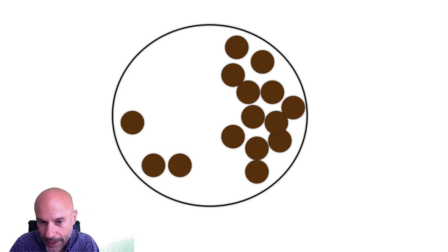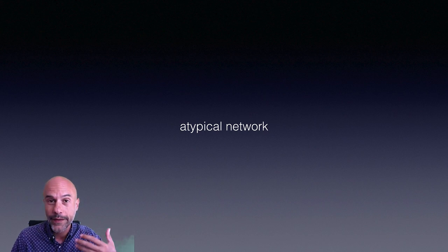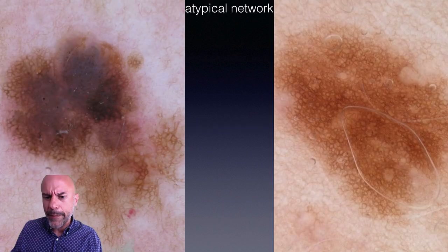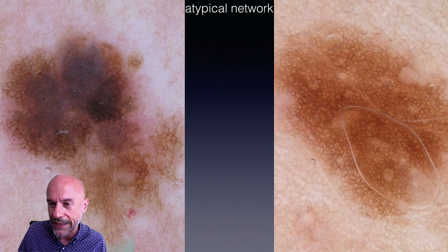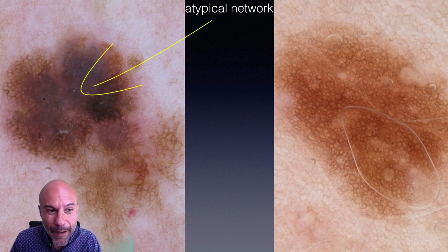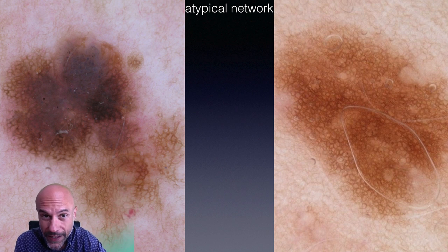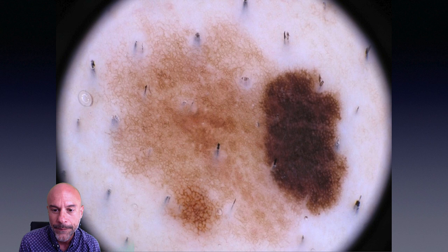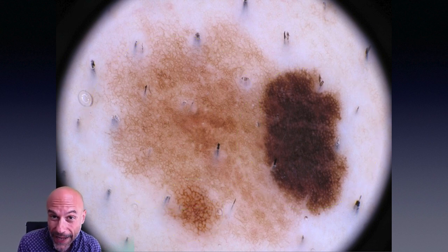What makes each structure regular or irregular, typical or atypical, is not the structure itself but the comparison between different areas of the same lesion. This applies to almost all criteria of melanoma. For atypical network, compare atypical on the left with typical on the right: the right has only one color, one diameter of holes, and same thickness of lines. On the left there is a black network in the upper part and a light brown network below, with much thicker lines above — this difference is precisely what makes the network atypical. In this lesion I would say we see three different types of network, and that is why it is atypical.